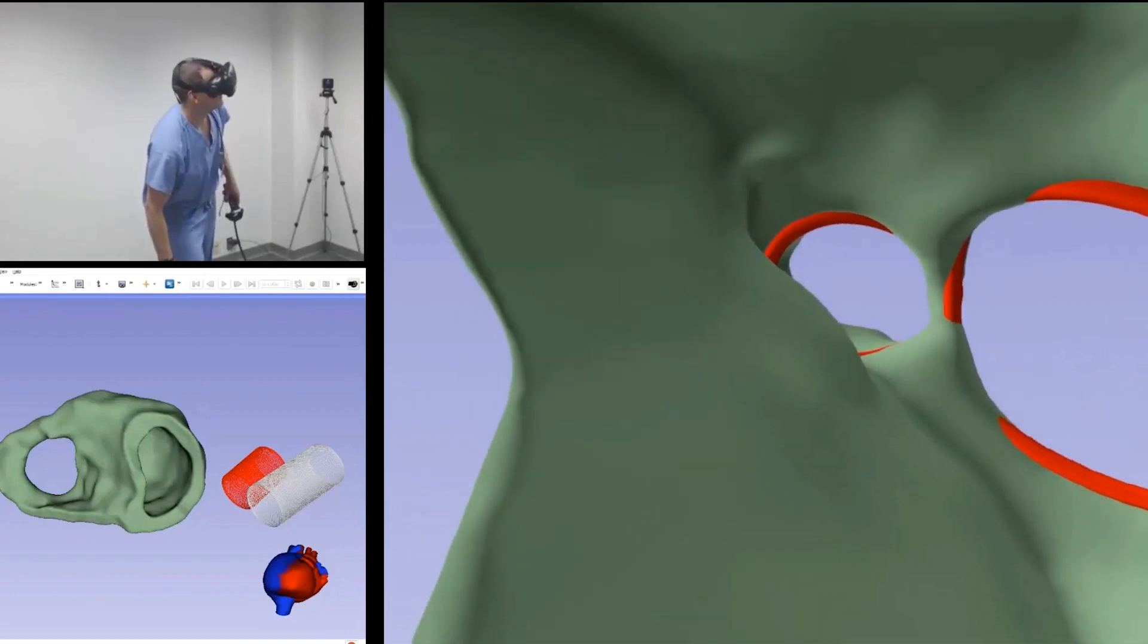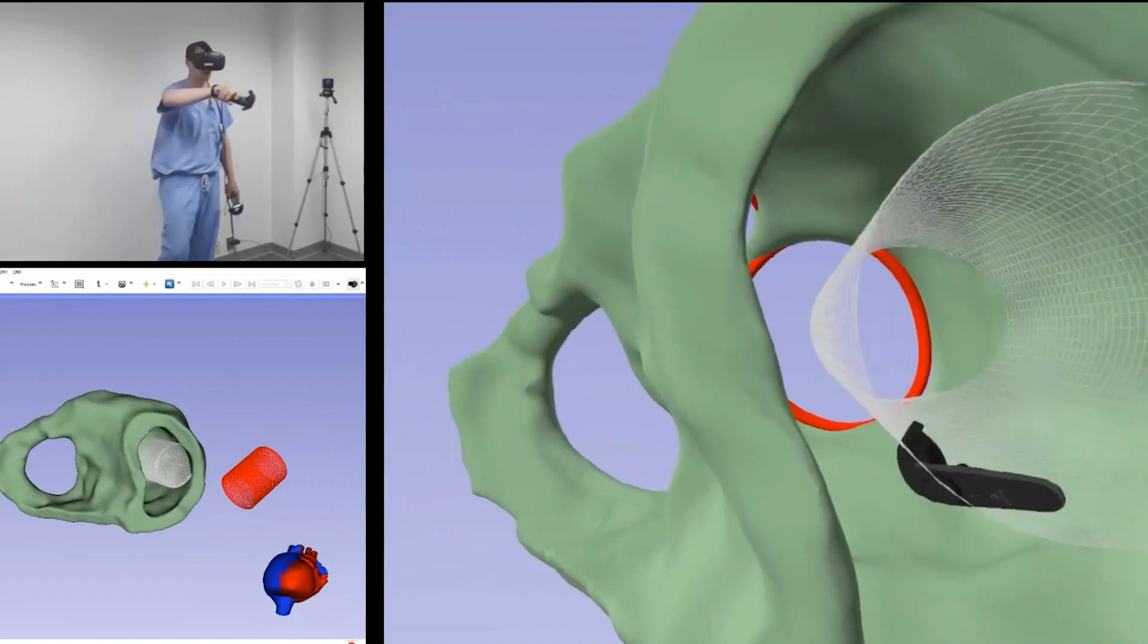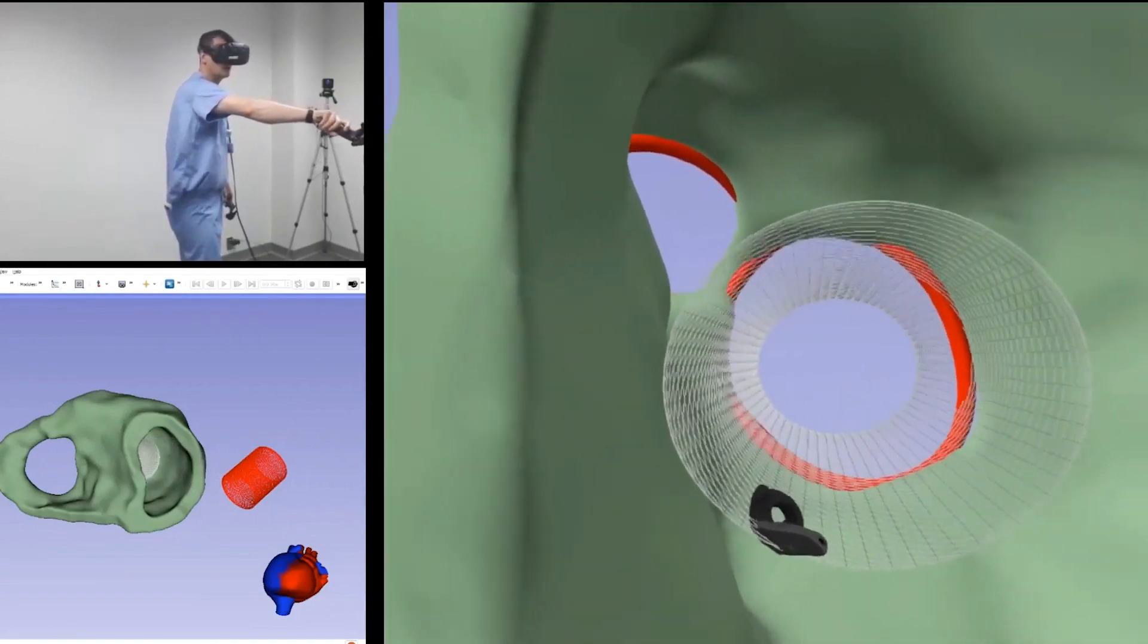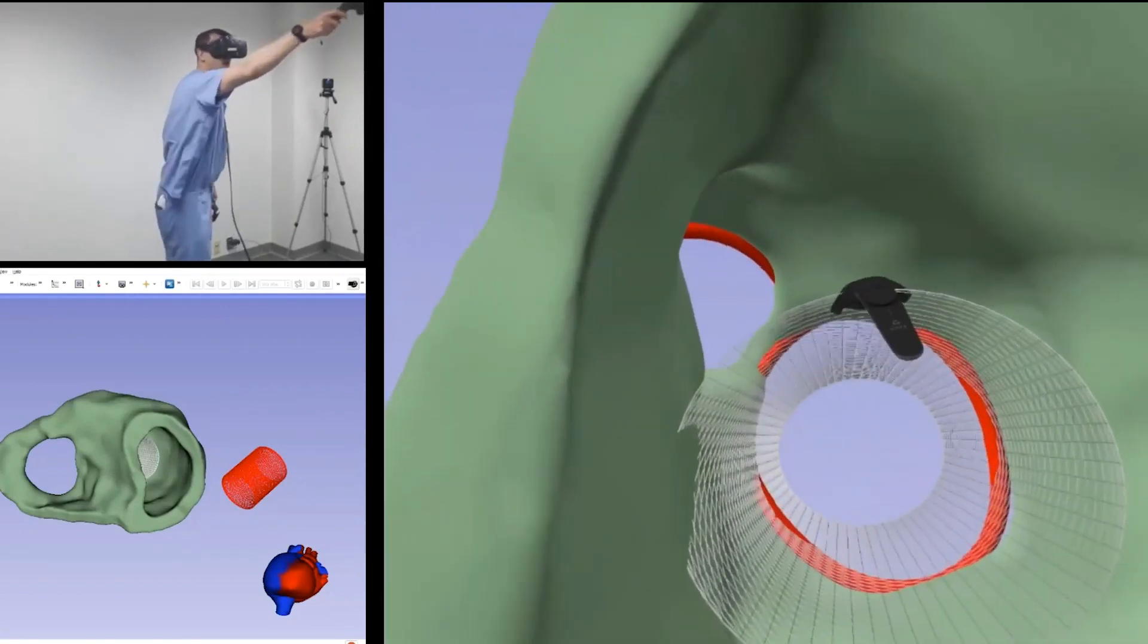Here, two devices are placed in different orientations to assess fit and the potential for LVOT obstruction. We first place a long device, roughly orthogonal to the mitral annulus.